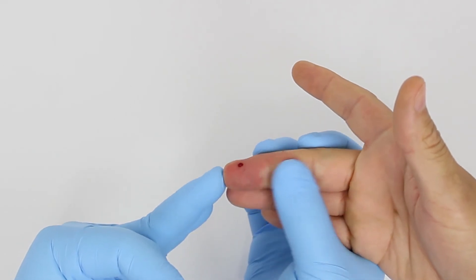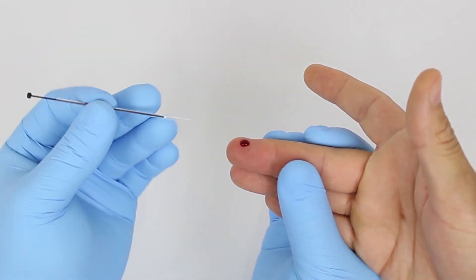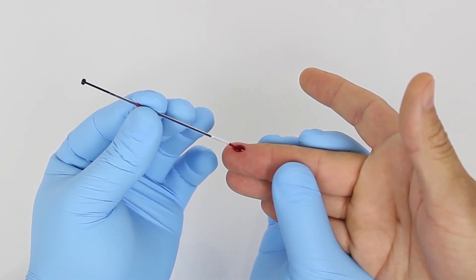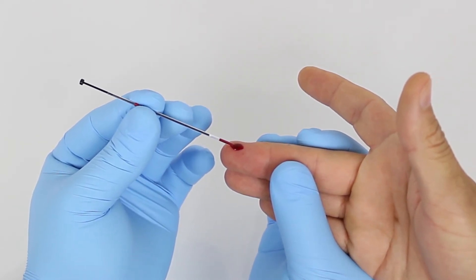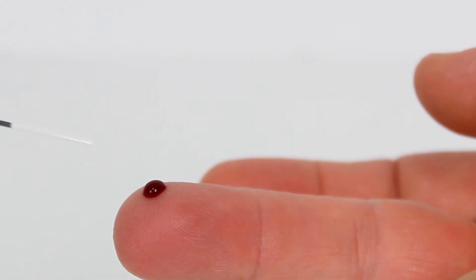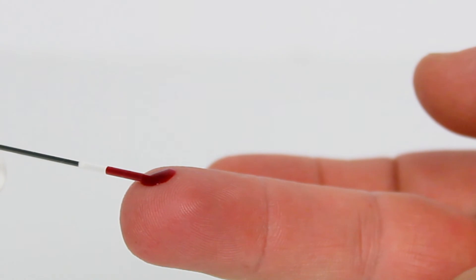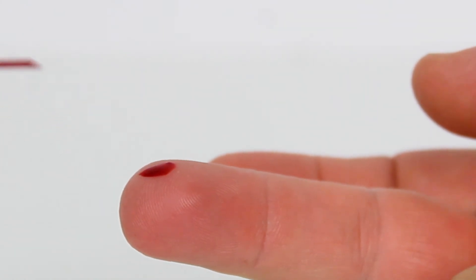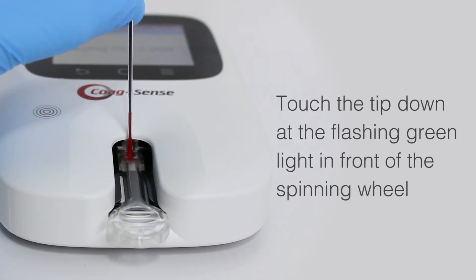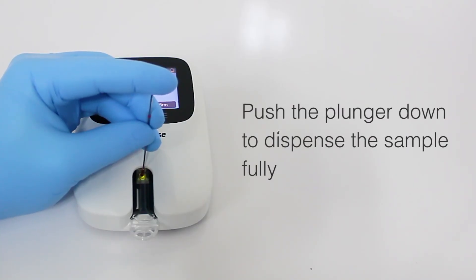A minimum of 10 microliters of collected blood sample is required. Please remember: squeezing or milking the finger stick site excessively releases interstitial tissue layer fluid containing tissue factors that can cause unreliable results. Collect the sample using a sample transfer tube. Holding the transfer tube horizontal, touch the tip to the bead of blood and let capillary action fill until the blood flow stops at the white plug. Insert the transfer tube tip into the sample application well of the test strip and touch the tip down at the flashing green light in front of the spinning wheel, then push the plunger down to dispense the sample fully.